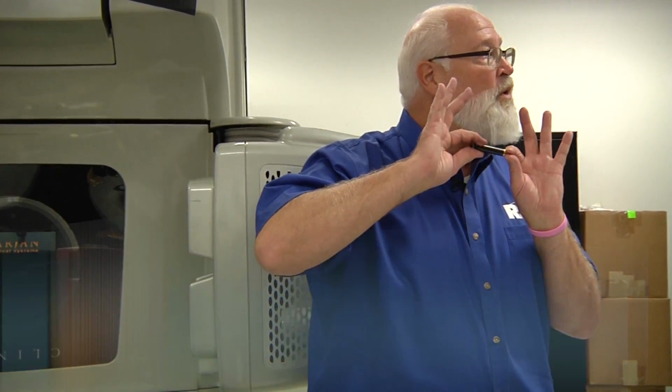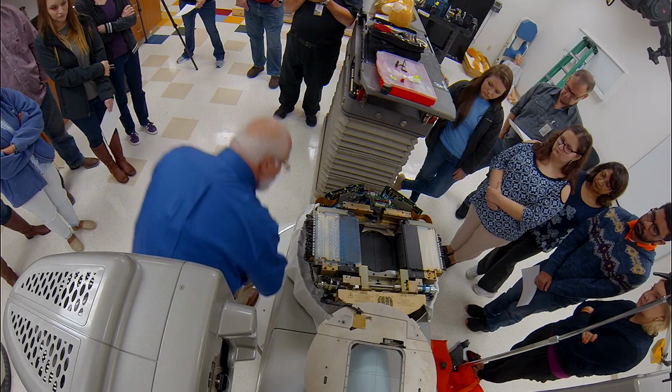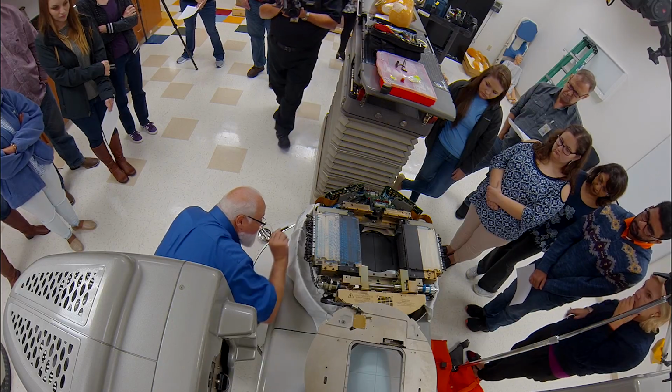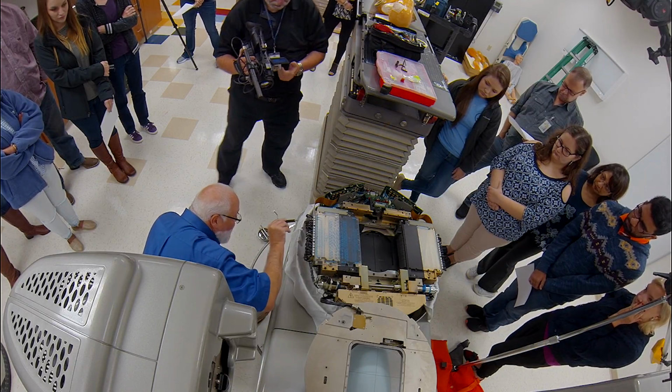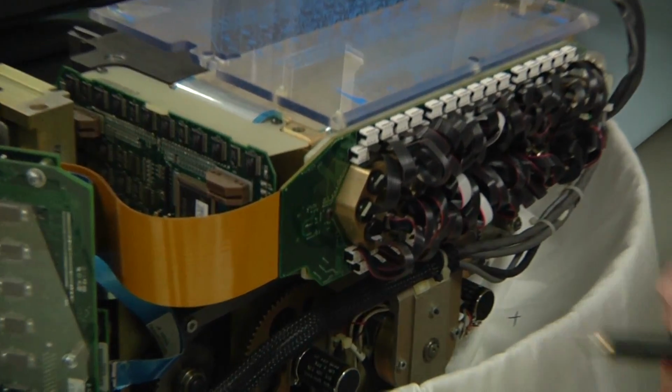Also, when you take the motor out, you want to spin it and listen for a crunchy sound. That's one way to tell that the old motor you pulled out is bad or has stopped working. Inside these motors are little brushes, and they'll fall off inside and jam, so your motor will spin one direction but not the other. Okay, then you want to match it up with the tangs of the coupler.